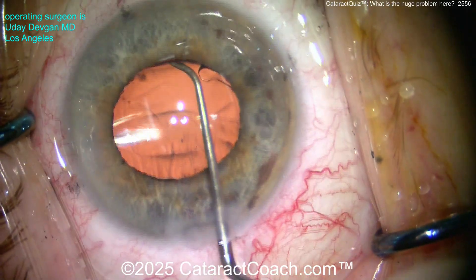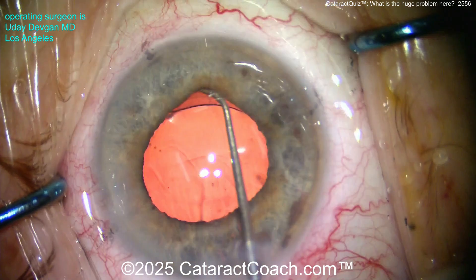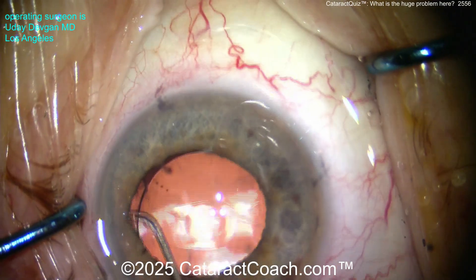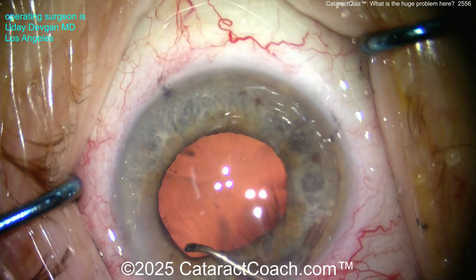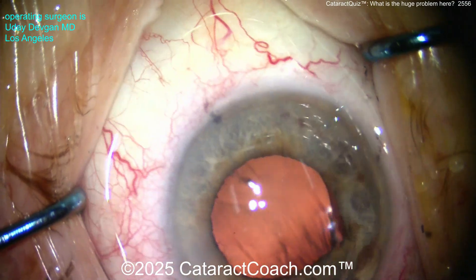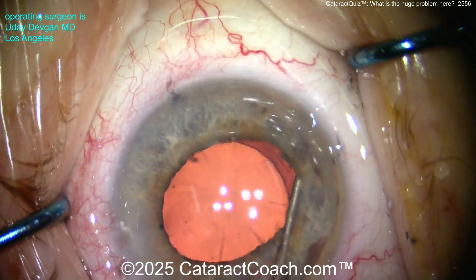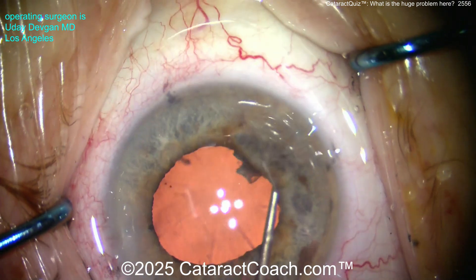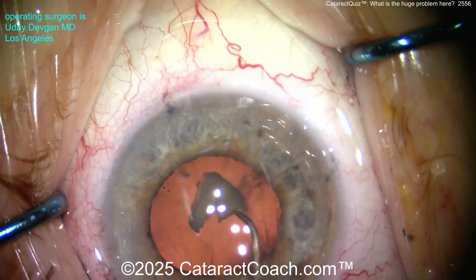Now do you notice the issue yet? Let me show you — lift up the iris here, that looks pretty good, okay. The lens is definitely in the bag, it's behind the capsulorhexis, both haptics are in the bag, the optic is in the bag. We just need to get the viscoelastic out. But look what happens — yo, what is that?! Look at this mega huge chunk — you will not believe this. Look at this chunk — wowza! That big nuclear chunk was just hidden under the iris.